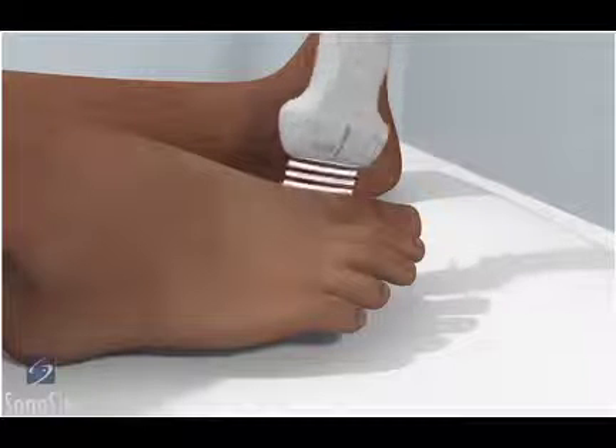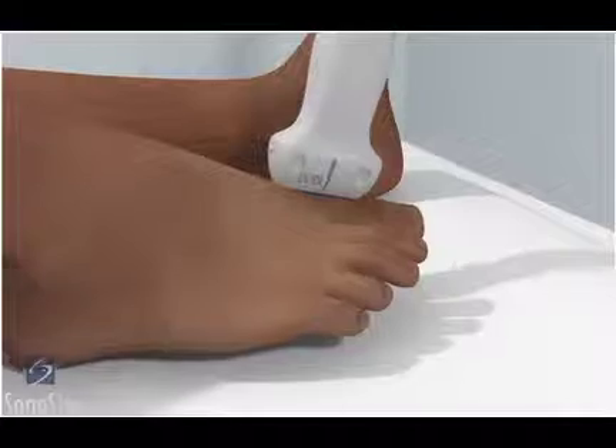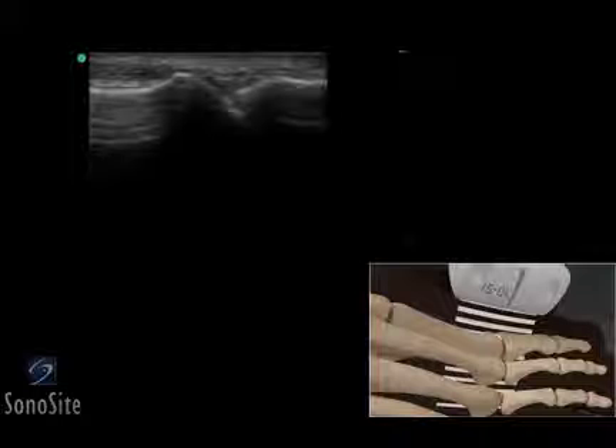The transducer is placed over the dorsal surface of the metatarsal phalangeal joint in a longitudinal fashion, with the orientation marker directed toward the patient's head.